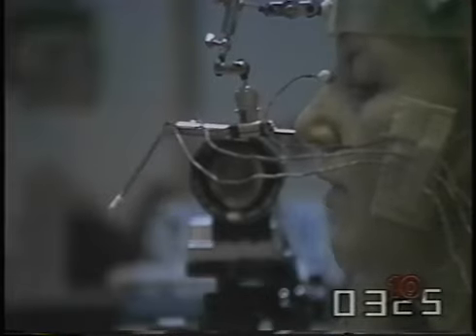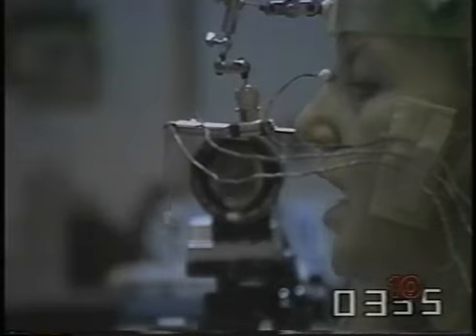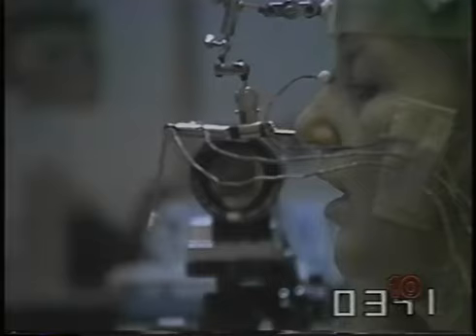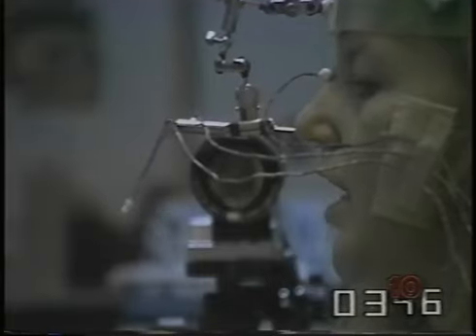The velotrace was developed to allow us to monitor these changes in velar position. It allows us to collect mid-sagittal velar position data in analog form, eliminating X-ray exposure to the subject, and frame-by-frame measurements of cine and video recordings by the investigator.